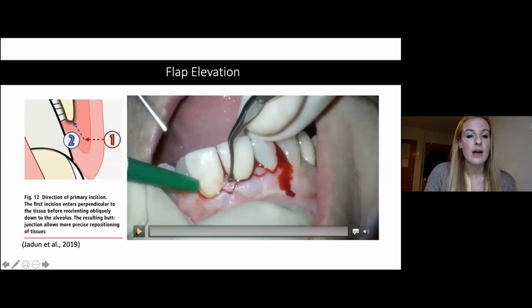This is just a little video to demonstrate a papilla preservation flap.